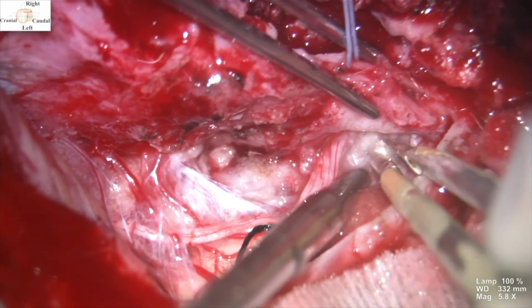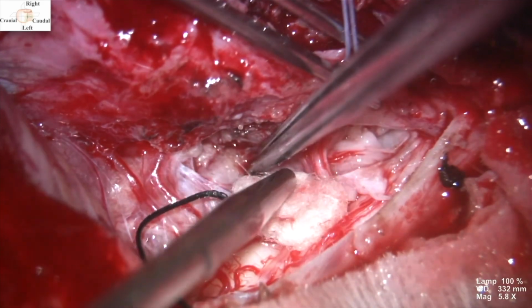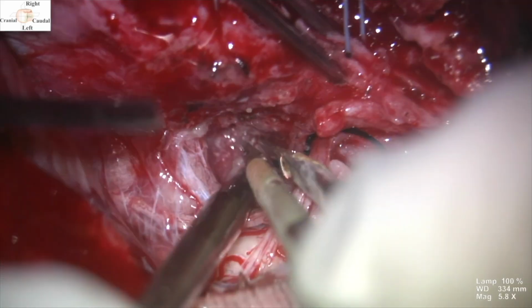Working through the windows below and above the dorsal nerve root of C2, the lateral dural attachment of the tumor was coagulated and the lesion was internally decompressed.